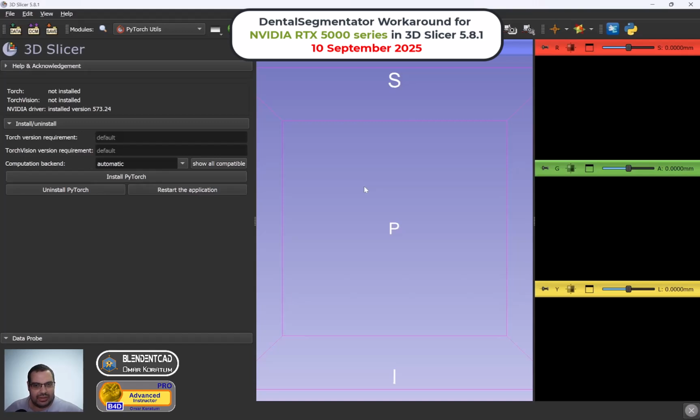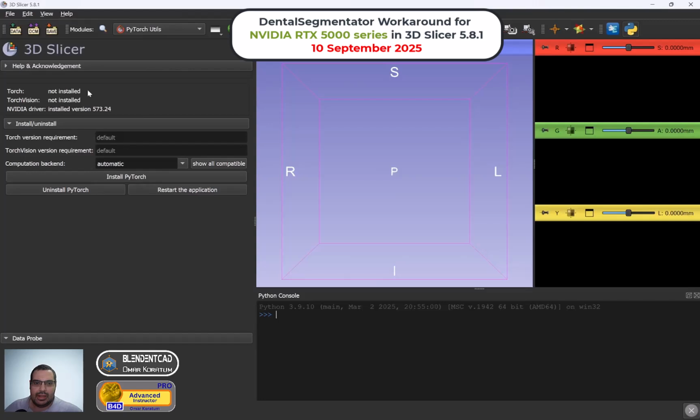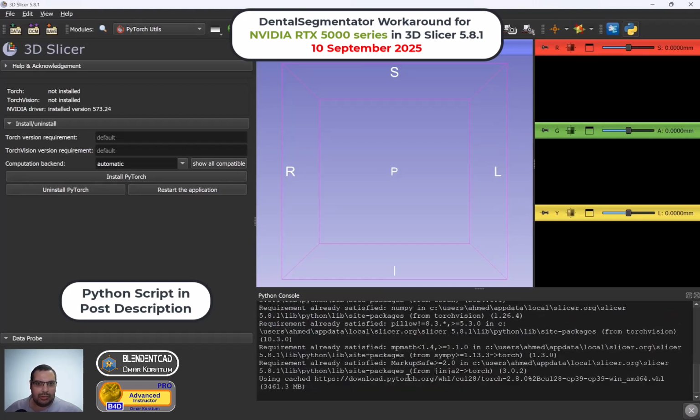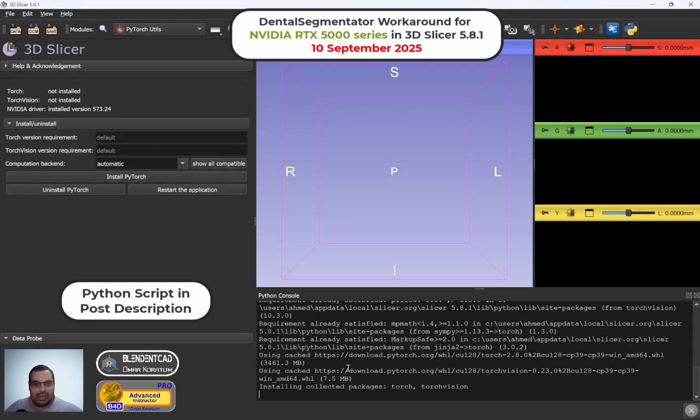So I asked ChatGPT and it gave me a Python script to paste inside the Python console inside 3D Slicer. To access this Python console, I'm going to press on View and then Python console. And now I'm going to paste the Python script that ChatGPT had provided me. What the Python script will do is install the latest and most updated PyTorch that will be compatible with the latest graphics card. So you have to wait a little bit until it downloads and installs the latest PyTorch. And then we are going to restart 3D Slicer again.